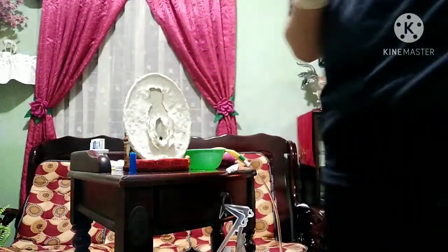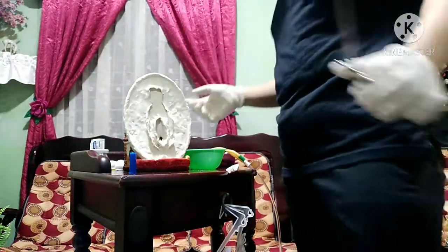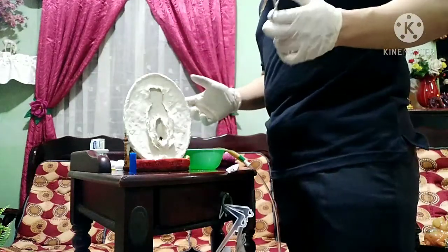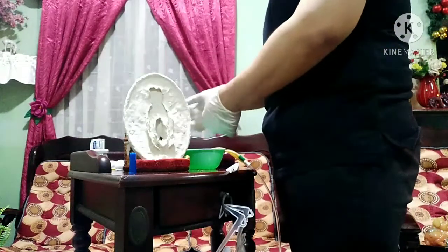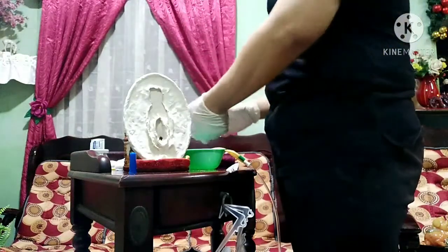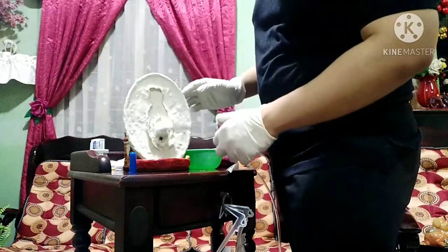Lilinisin na po natin yung perineum po with soap and water po and dry area po. So, i-clean na po natin siya. So, nakita po cotton balls po. So, may soap siya. So, i-clean na po natin siya. One stroke at a time. Just discard po. Clean.